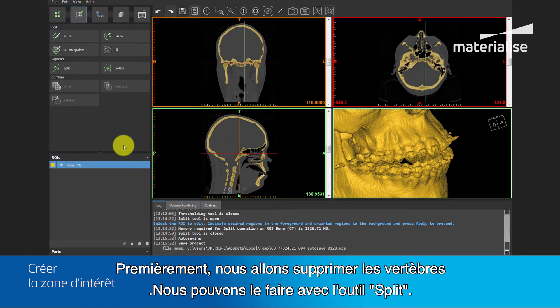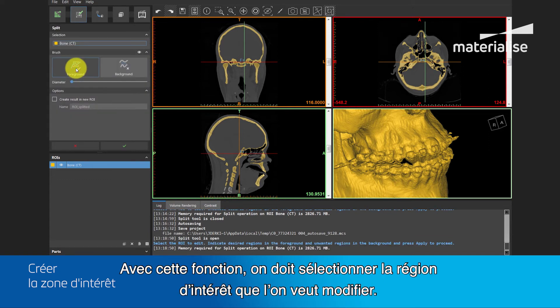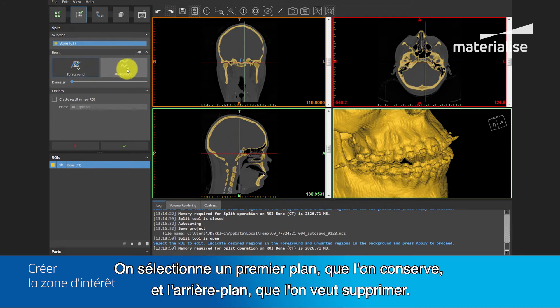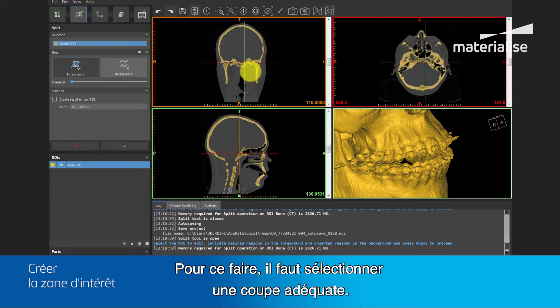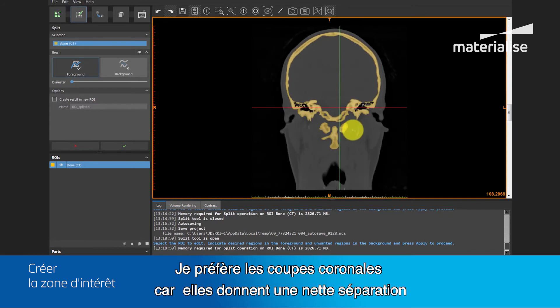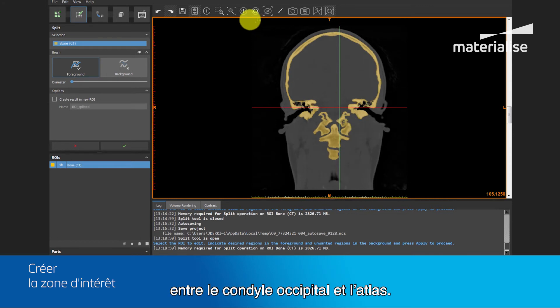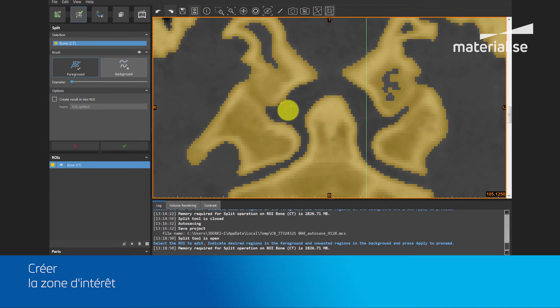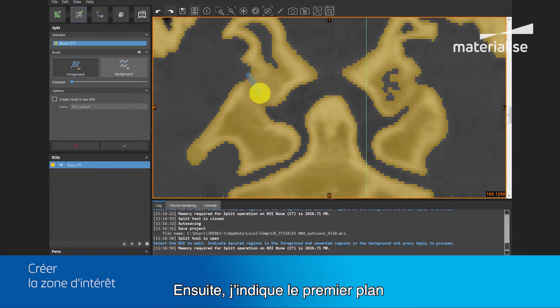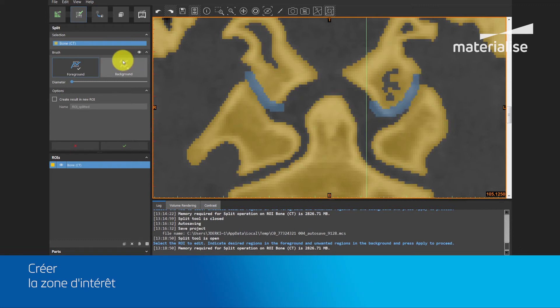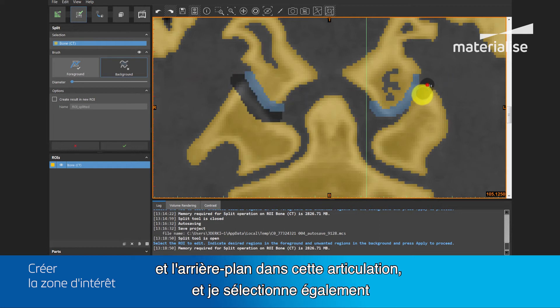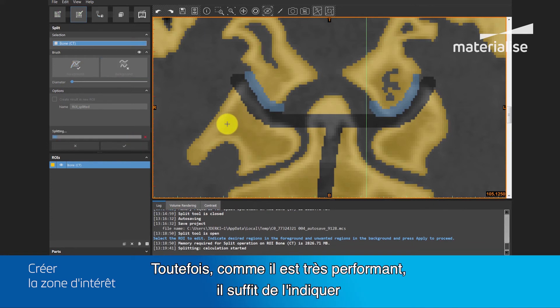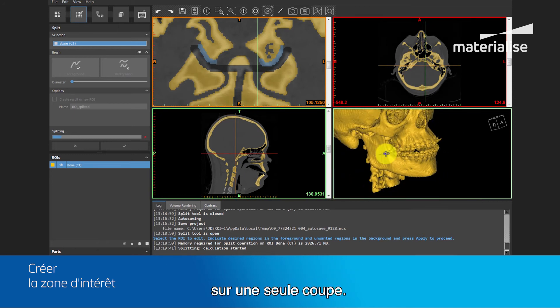First, let's delete the vertebra. We can do this with the split function. In this function, we need to select the region of interest we want to edit, select a foreground that we want to keep, and the background that we want to get rid of. I prefer the coronal slice because this will give a clear separation between the occipital condyle and the first cervical vertebra. I will enlarge the view with the space button, then indicate the foreground and the background in this joint, and also select the rest of the vertebra. This tool can be used on multiple slices per iteration. However, it's so powerful that for this operation, I will only need to indicate it on one slice.